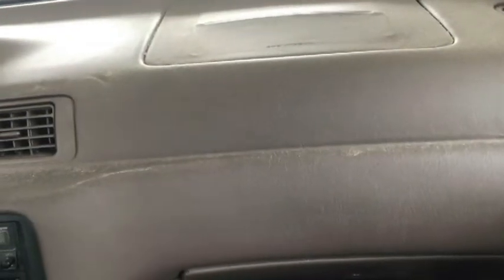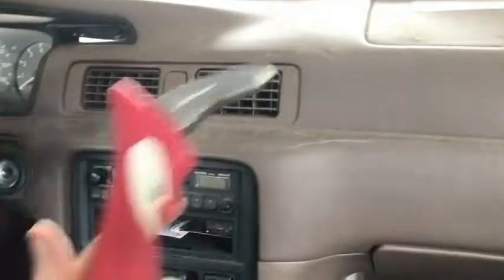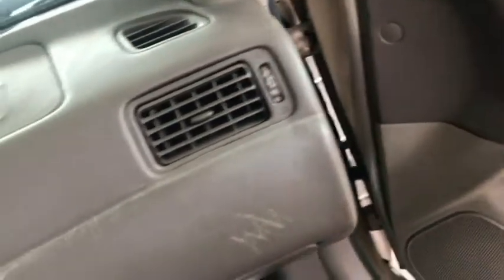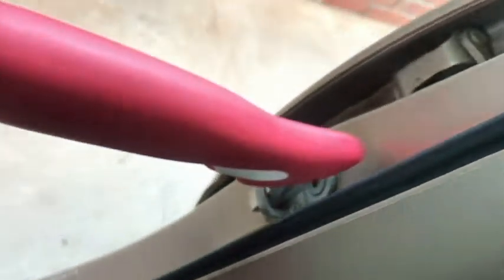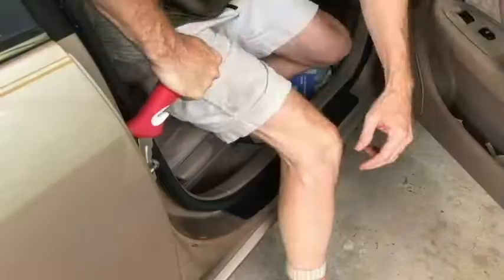Another scenario might be you're a passenger in a car and you just got back from eating a big dinner buffet and you're in a lowrider car, and so you're going to need some assistance, or it's going to be helpful anyway to use the handy bar. So you grab the handy bar wherever it may be, ask the driver to give it to you, and put it in your striker. I am right-handed, so I would just see how low it is. Oh, it's going to be hard to make that. Pull your body up.